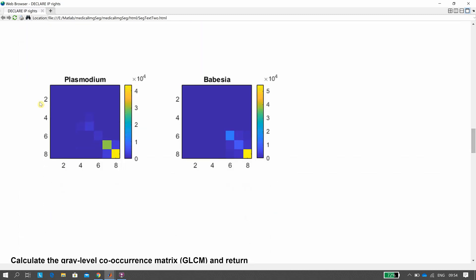There are the scaled images. When you scale here, the default is an 8-by-8, so by eyeballing it that's 5. The original Japanese presenter says the same thing. There is the parasite — we're not too worried about the babesia. So we want to figure out where all the value 5s are, and the value 5s are what we think is the plasmodium.